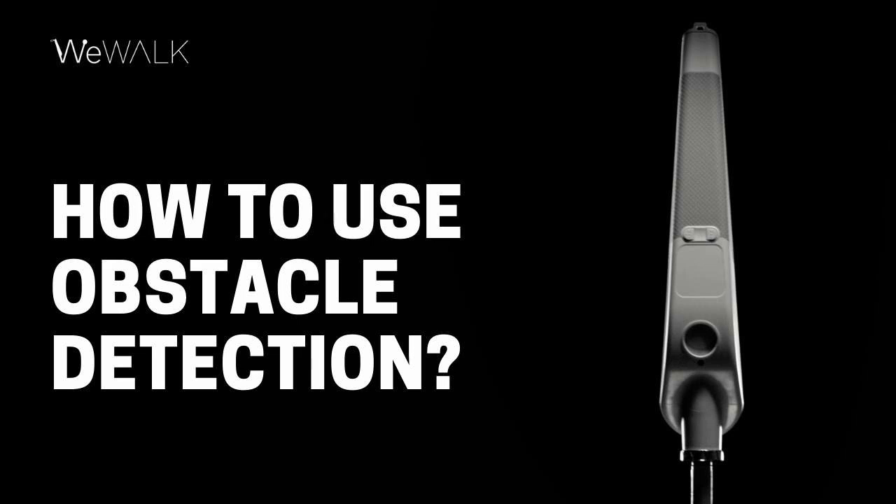We will now talk through WeWalk's obstacle detection feature. The obstacle detection feature works in conjunction with your white cane and mobility skills to notify you of above ground obstacles. These could include signposts and low hanging tree branches.